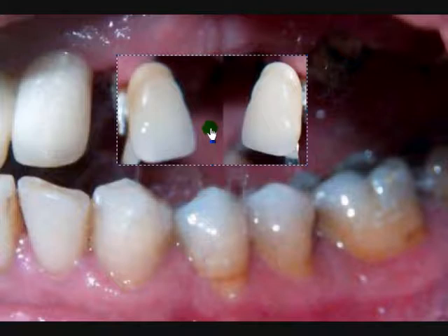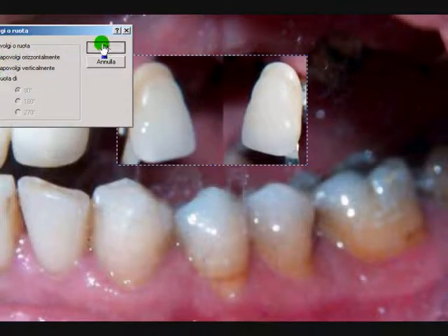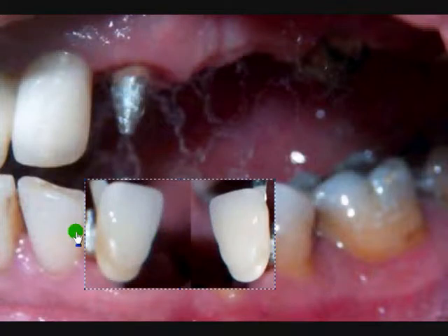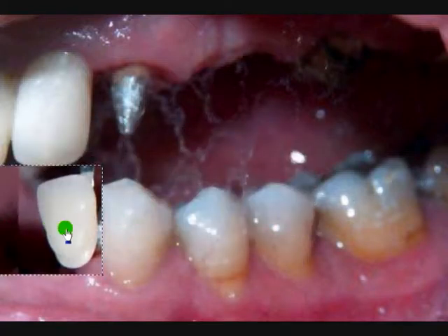So I can also rotate this image here. Here we go. Okay, and put it right next to it. Look at this lateral, how it matches well with the D2, and I guess this A2 here does match the existing bridge. So I guess the evaluation of these colors has been done with the premises that I have just pointed out to you.